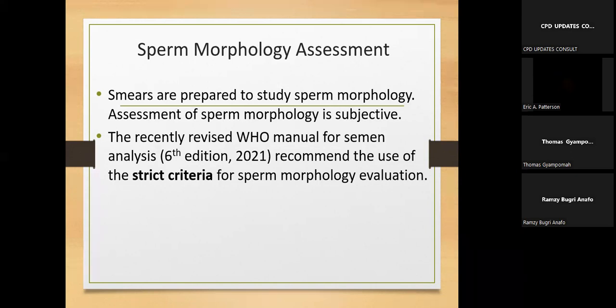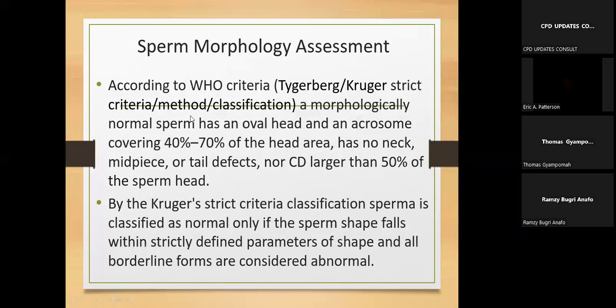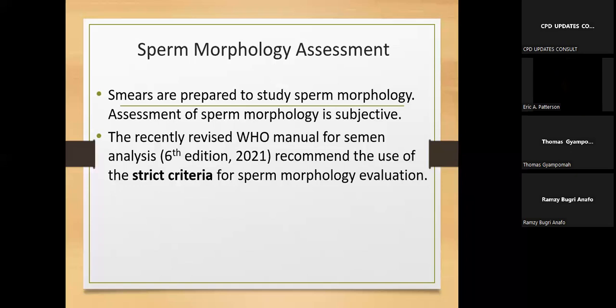Here we're going to look at how we will... I think we can, let's give you some five minutes. I think we can do the sperm morphology and then we move on. So with the sperm morphology, of course, smears will have to be prepared.